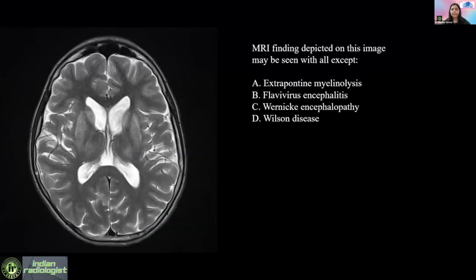Flavivirus encephalitis and Wernicke's encephalopathy — this is something we revise often: T2 basal ganglia symmetric hyperintensity and its differentials.